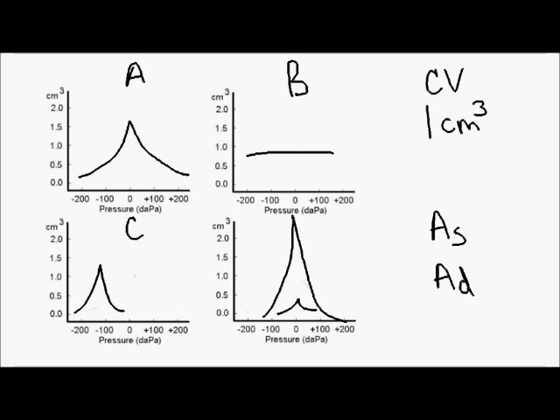The other type of impedance is acoustic reflexes. An acoustic reflex occurs when you send a signal through the afferent pathway of the 8th cranial nerve, and it sends a signal back through the efferent pathway of the 7th cranial nerve. This is done by putting a sound in the ear canal, which is transmitted through the cochlea to the auditory nerve. The pathway then travels through the efferent 7th nerve pathway, causing the stapedius muscle to contract. This, by the way, is the smallest muscle in the body.